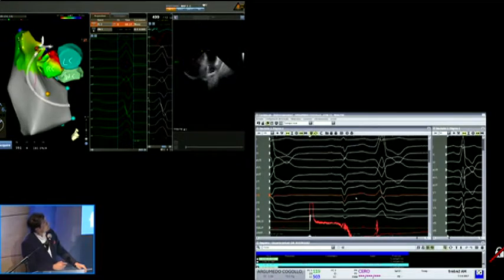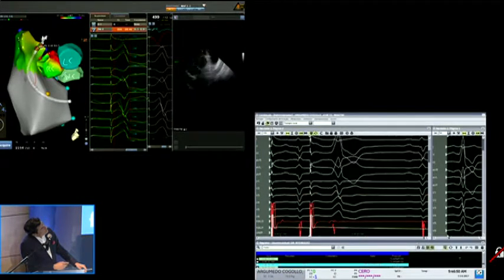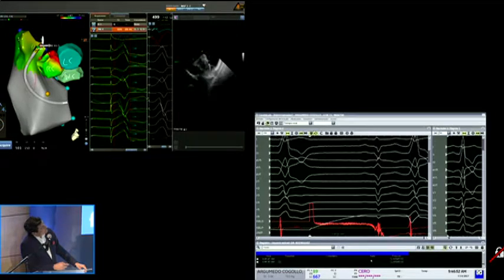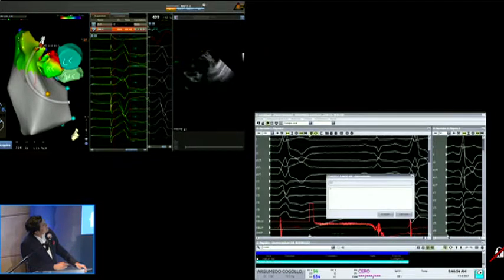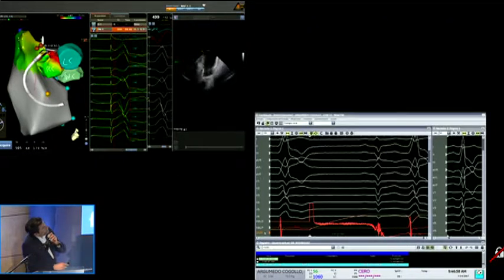It's capturing here. Let us take this pace map point. Maybe you are upper to the valve, right? Luis, here we have a pace map of 0.912.